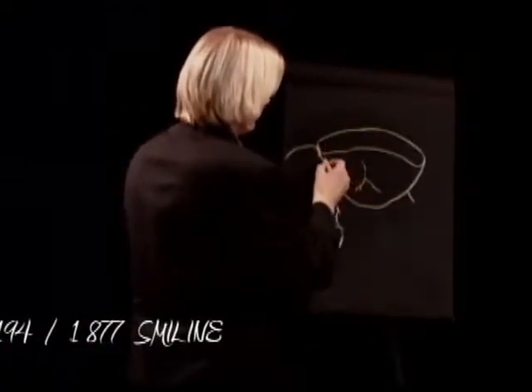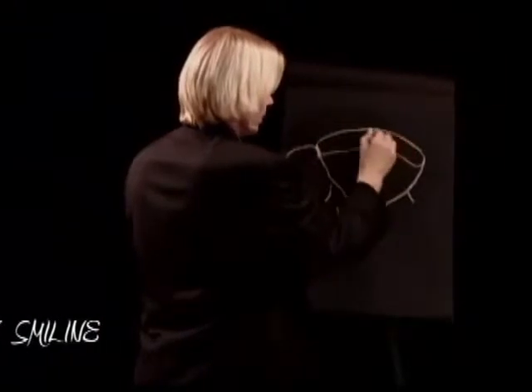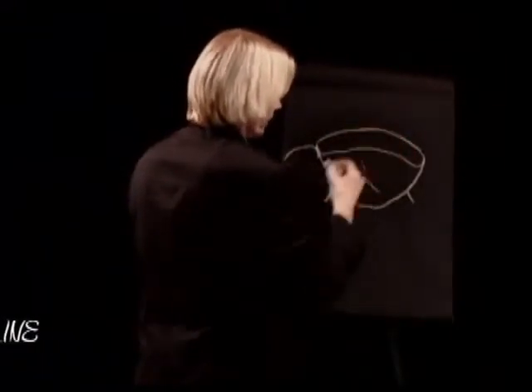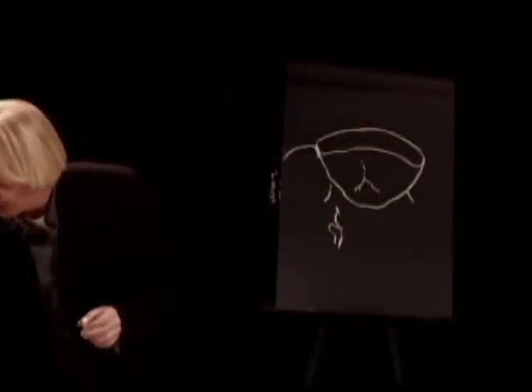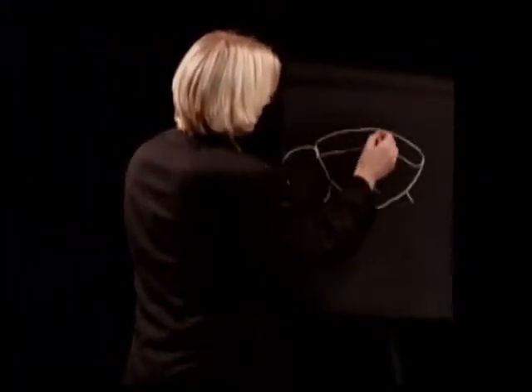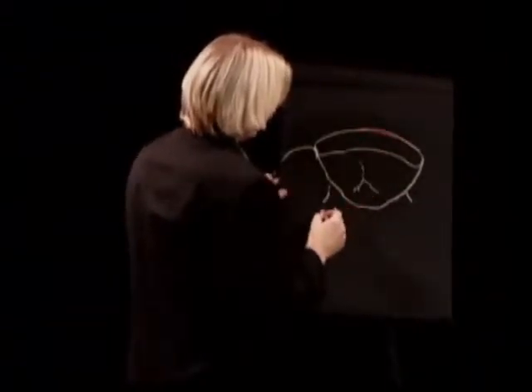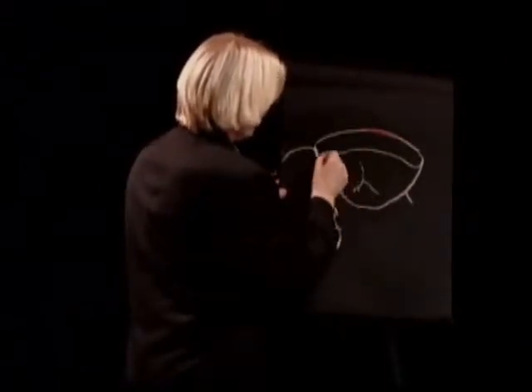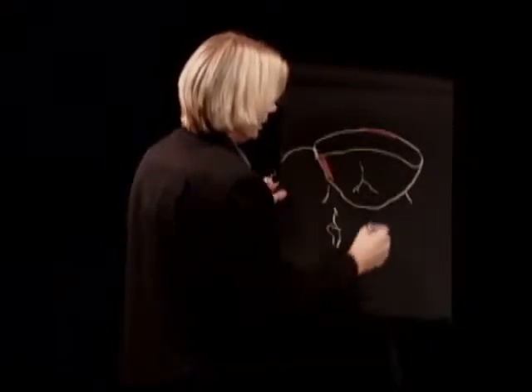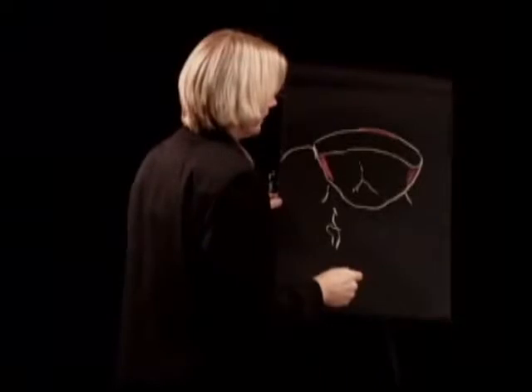Now if you have fillings or you have a misaligned tooth, let's say this one is sticking out too much, you will have to reduce more in this area. And I'm just going to point that out by showing the reduction area. So if this is sticking out too much, you will have to reduce it here a little bit more. If you have a cavity here, you have to remove that cavity. If you have a filling here, you will have to remove that old filling.